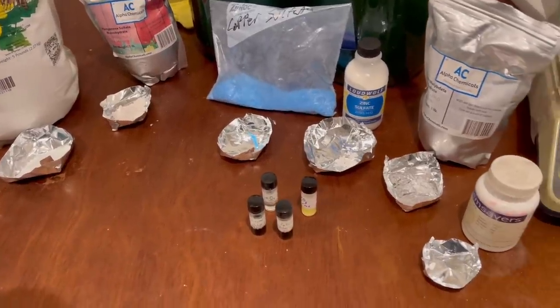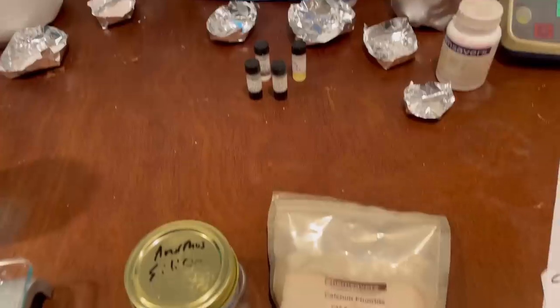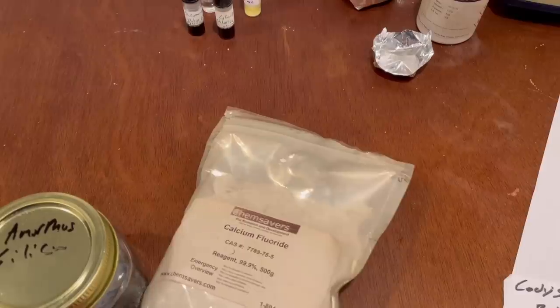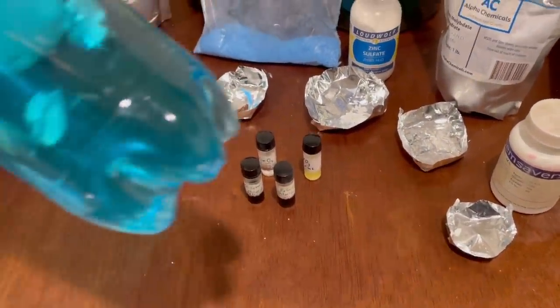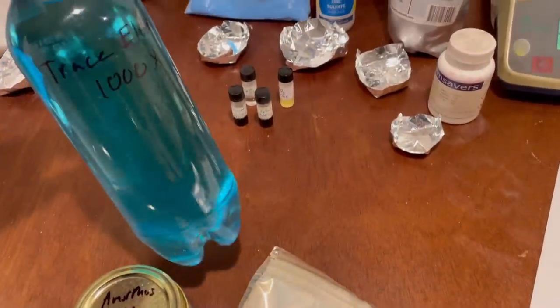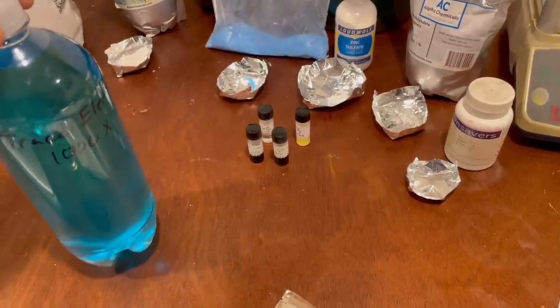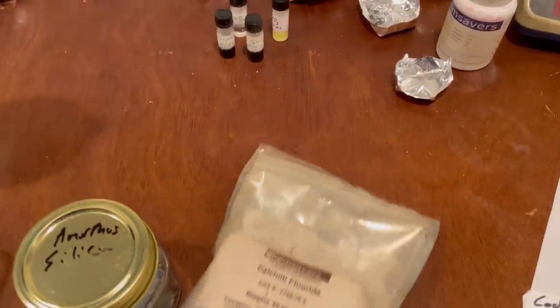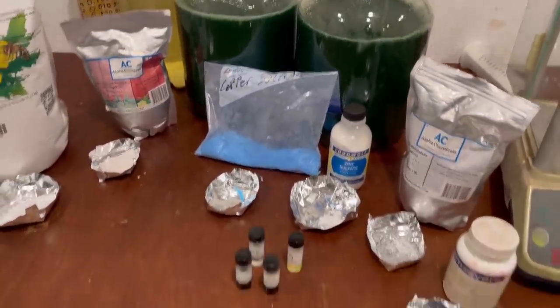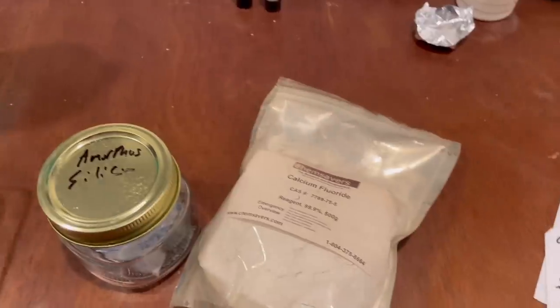I've weighed out all the ingredients for the trace element solution — much less copper this time. You might also notice I've omitted the calcium fluoride and the silica. That's not because fluoride is dangerous; it's because both end up on the bottom of the container. Their solubility is very low, and given how concentrated this solution is, the amount actually ending up in my final media would be tiny. It would be much more sensible to add them to the water directly. This algae doesn't really need them anyway — silica is really only useful if you're growing diatoms.